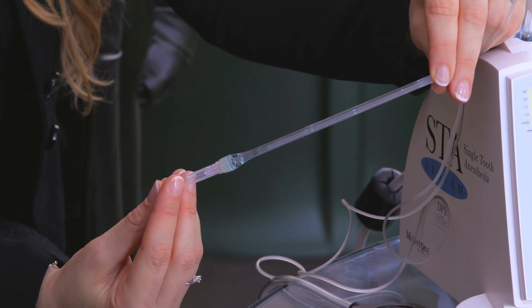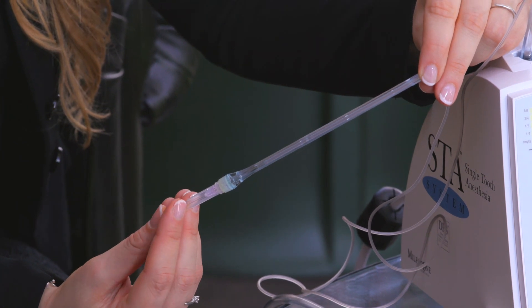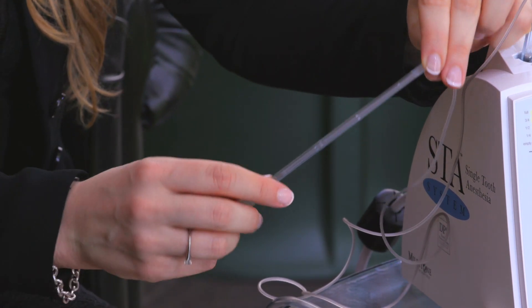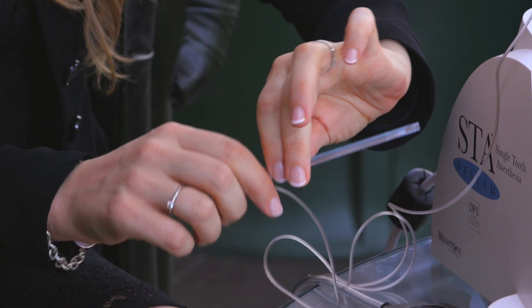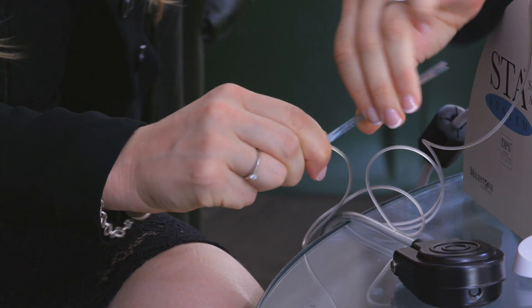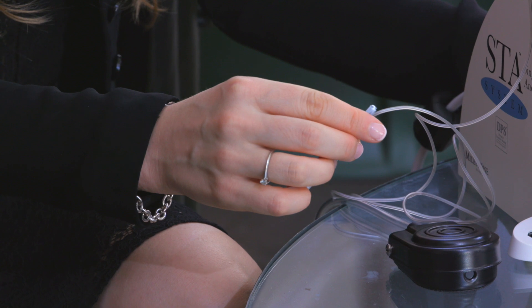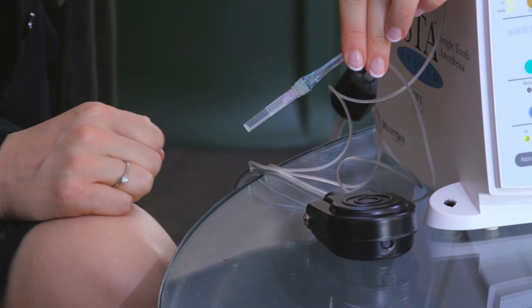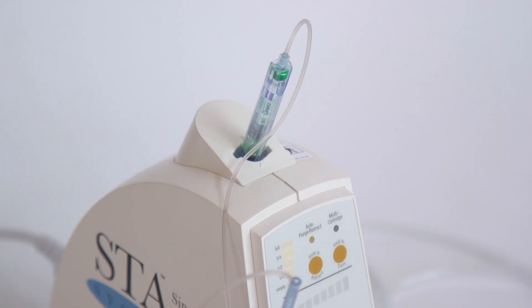You can choose to keep the handpiece as it comes, or you can shorten it by just breaking one piece of the handle, like this. This can be useful to reach the farther zones of the mouth in patients that do not open much.